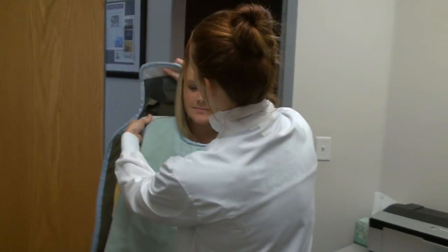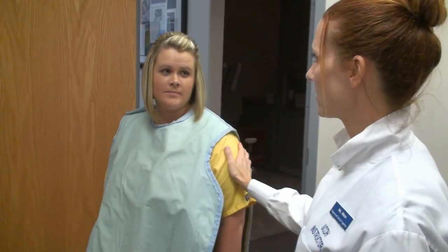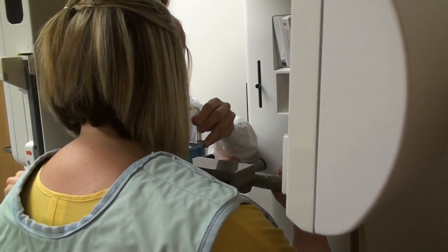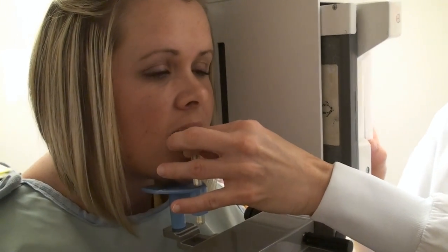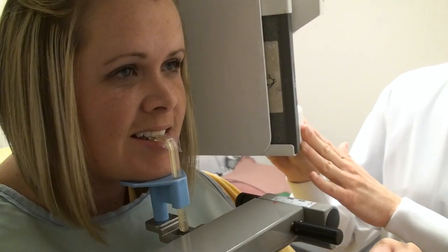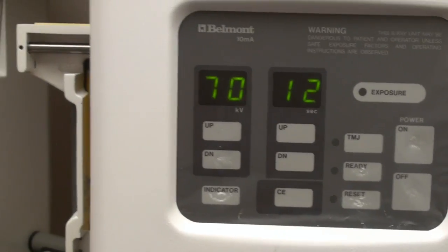We're going to take the lead vest and slide that right on the patient. Eyeball the machine to make sure the patient can walk in without hitting her head or chin on the bite guard, so bring it down a little further. Have her hang on to the handles, raise the unit up, and have her take a step forward until she feels your feet. Have her bite right onto the bite peg and scoot back until her teeth fit into the little groove. Then drop the chin onto the chin rest. Push the indicator light button so we can see what we're doing and use those lights to position the patient.